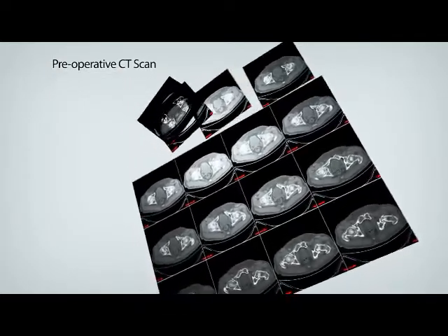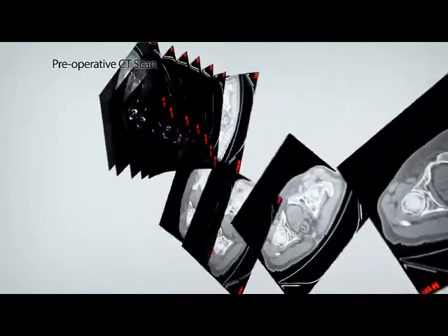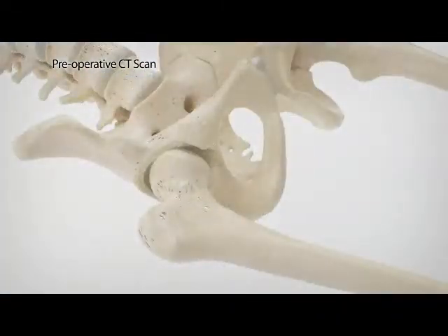Surgeons preoperatively plan each patient's Makoplasty total hip procedure. The CT scan and Rio provide a three-dimensional view of the joint and diseased anatomy, enabling an optimized procedure plan.